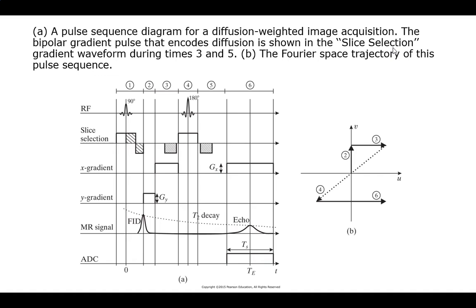So now we're going to take a look at some diffusion weighting images. Again, when you're looking at these, this is kind of your whole walkthrough on it. It'll look very similar to what we've got. Each of these ones is going to depend on what you're doing and what matters to you.